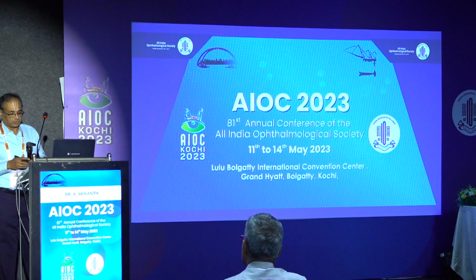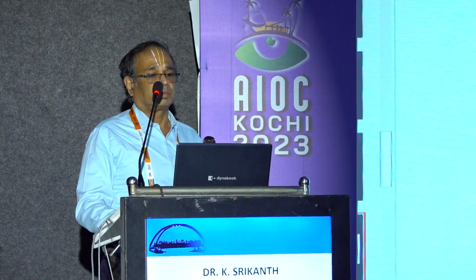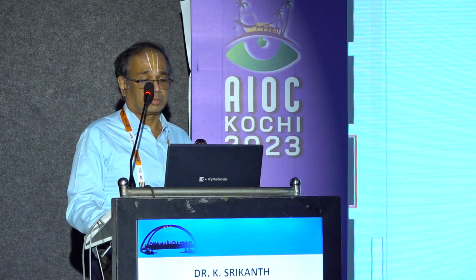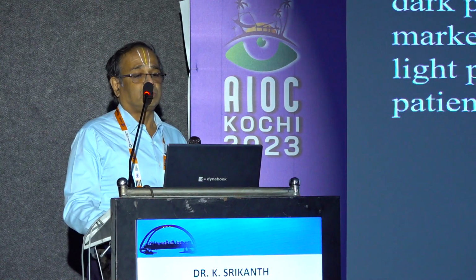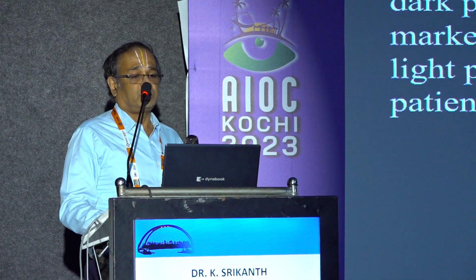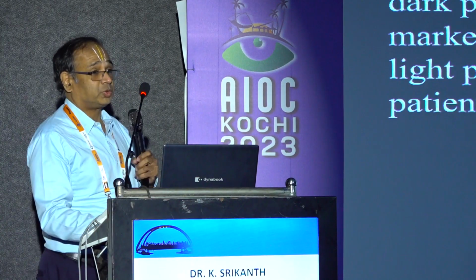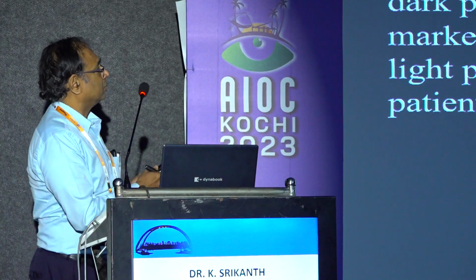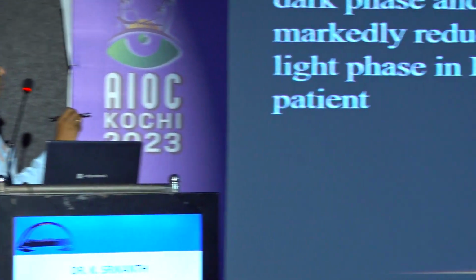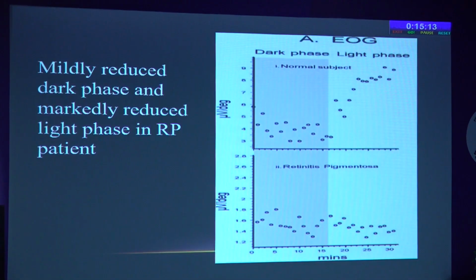Any doubts? How will you make out the light phase and the dark phase in these charts? This is the dark phase. The wave is not there, but it is represented in a different way. This is the normal one, but represented in a different way.